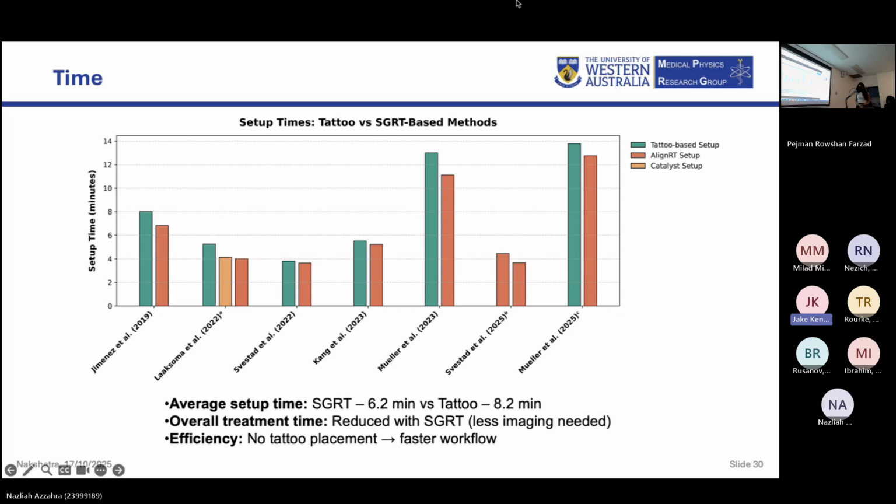However, when considering the total treatment time, SGRT is efficient because it reduces imaging time, and also the time to place the tattoos can be skipped.